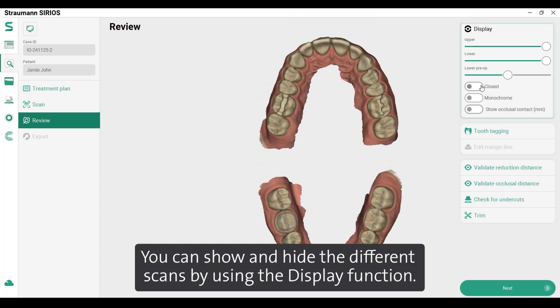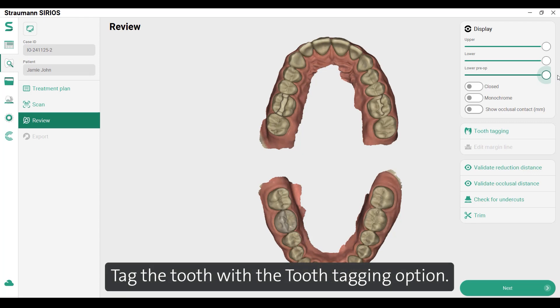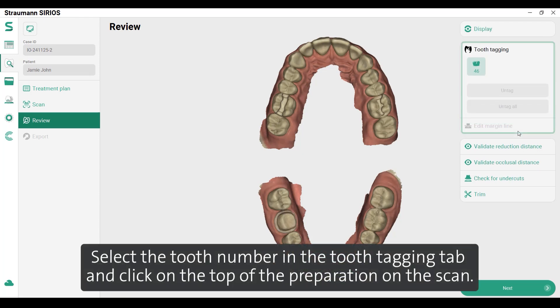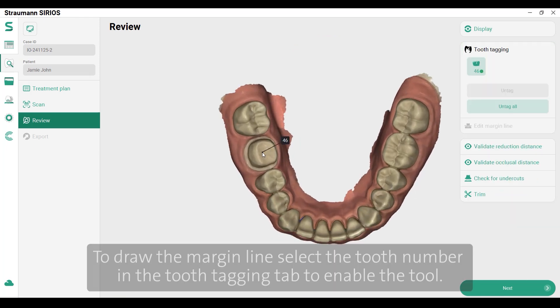You can show and hide the different scans by using the display function. Tag the tooth with the tooth tagging option — select the tooth number in the tooth tagging tab and click on the top of the preparation on the scan.